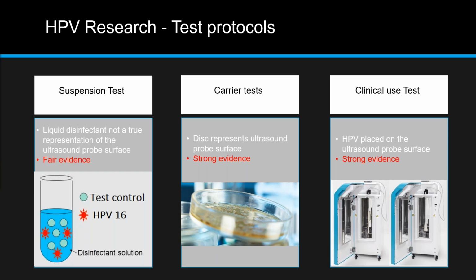We've done a few studies using what we would call the suspension test, which is really just taking a small tube and mixing the virus with the liquid disinfectant that we wanted to test. And this can provide some basic evidence on whether the disinfectant can work or not, but it doesn't really recreate the situation that you would see in a clinical laboratory or a clinical institute.